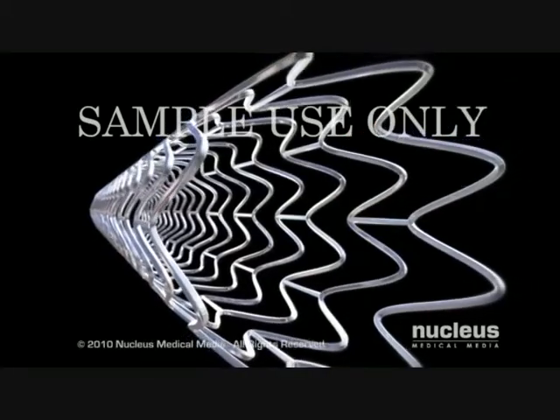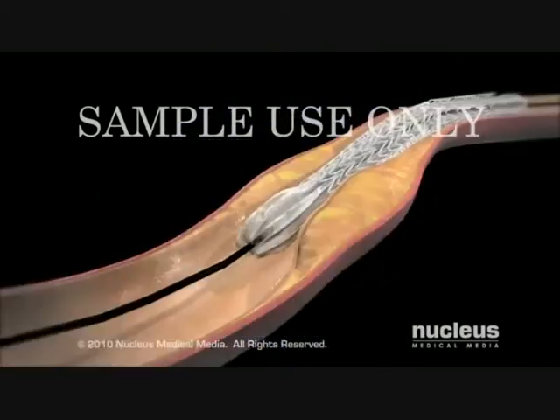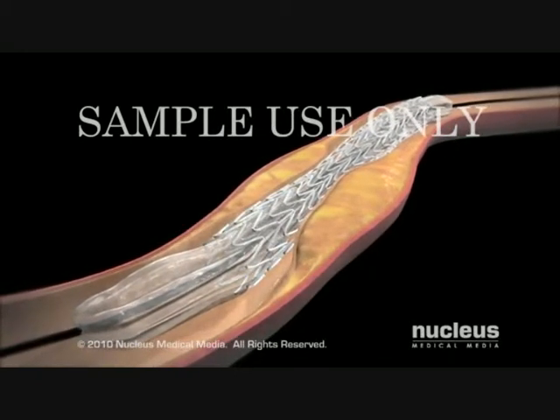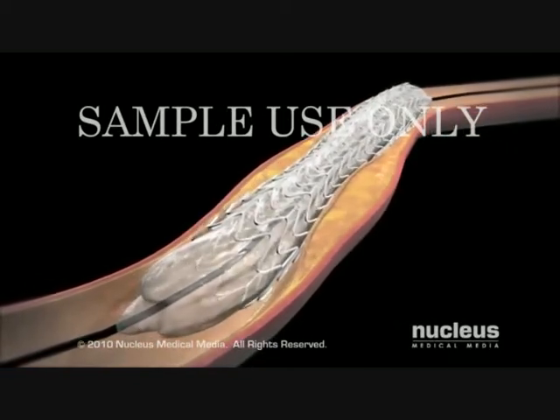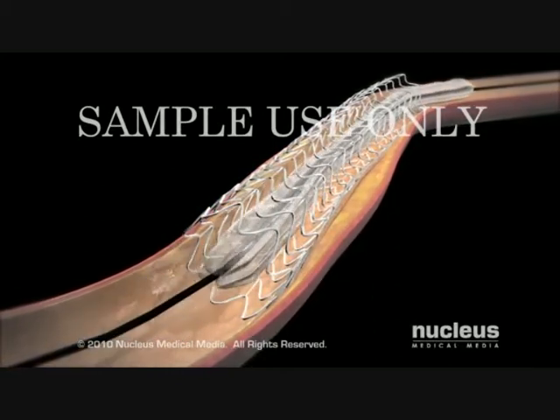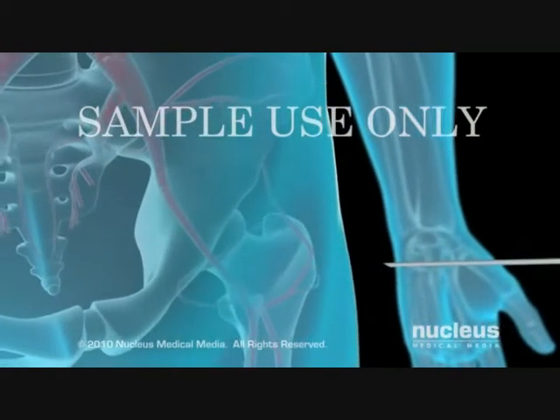In some cases, your doctor may place a stent, which is a wire mesh that remains in the artery, to hold it open. To perform this procedure, your doctor will place a collapsed stent over the deflated balloon on the tip of the catheter. When the balloon is inflated, the stent expands and locks into place. At the end of the procedure, your doctor will remove the catheter through the original insertion site.